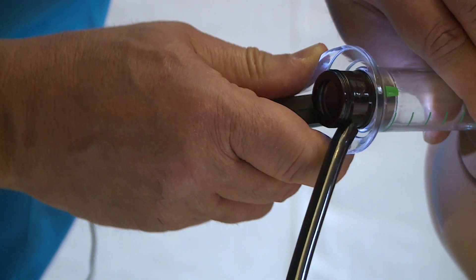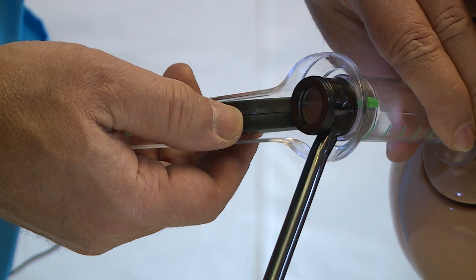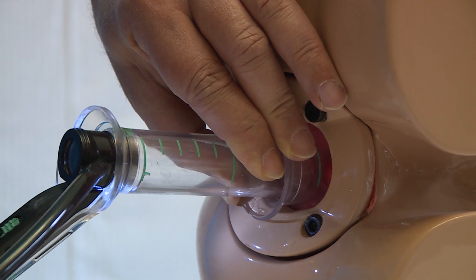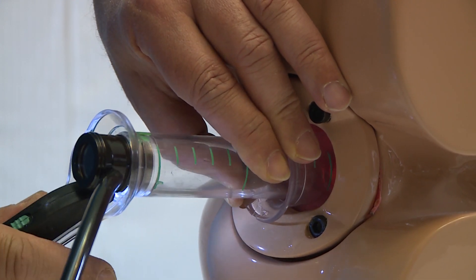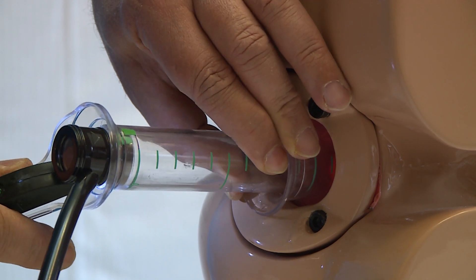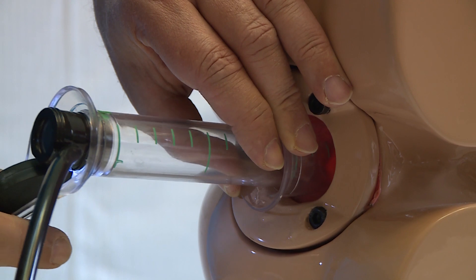By rotating the sigmoidoscope, we can now visualise the first hemorrhoid, the second hemorrhoid, and the third hemorrhoid. There is a space between the sleeve and the sigmoidoscope tube which allows excess air to leak out, further reducing patient discomfort.